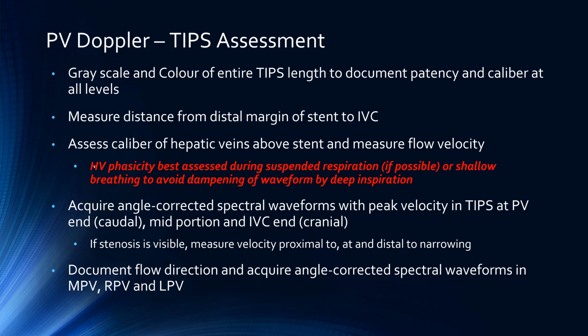Just one point around assessing hepatic vein flow. Really, this is best assessed during suspended respiration, or if that's not possible, shallow breathing, just as the waveform can be dampened a bit by deep inspiration. But obviously, if visibility is limited due to the patient's condition, then do what you can.